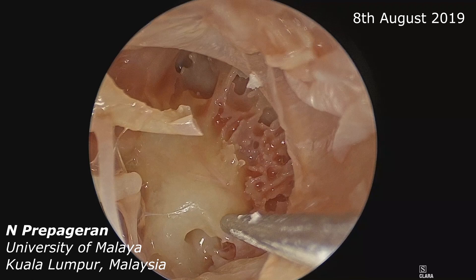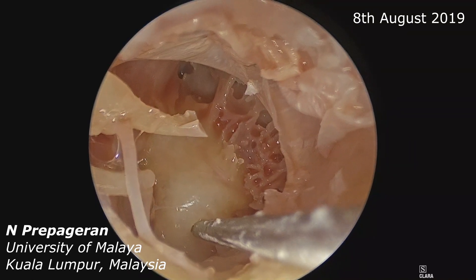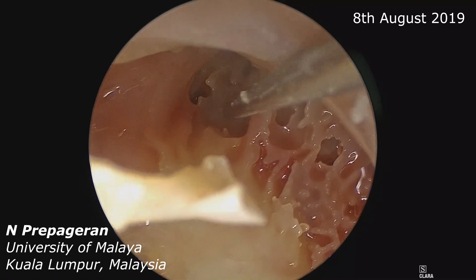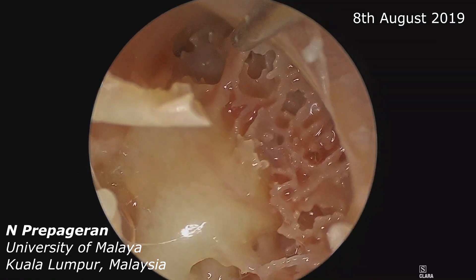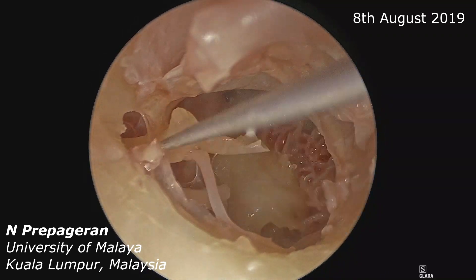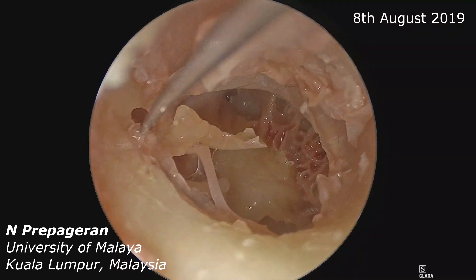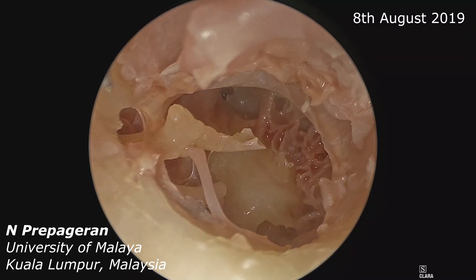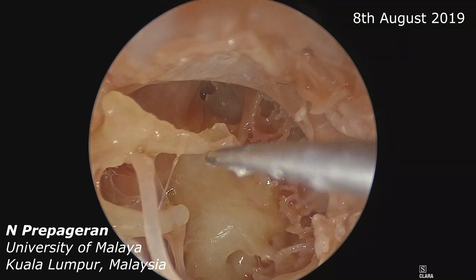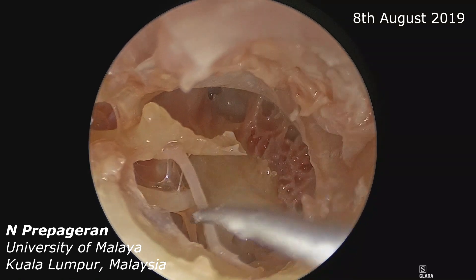P, S, F. You can see the round window and the eustachian tube. There's a discoloration here — behind the eustachian tube will be the carotid artery. This is the lateral process. This is where the attic pocket will be — the Prussak's space and the space of von Troltsch to the right and to the left. You can see how the ossicles are all kept intact.